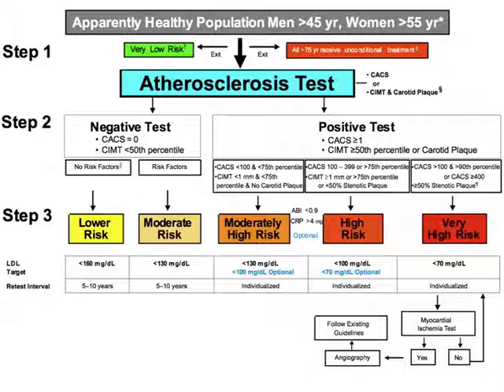over time. Now, historically, it's been difficult to get serial CIMT measurements because it's hard to do logistically. Patients get lost to follow-up, they don't keep their appointments. You have to get these people in to see a sonographer on a regular basis, and sonographers are expensive. So that's why CIMT, while it has some good data behind it, hasn't really taken off the way people thought it would, because logistically it's been difficult to do.